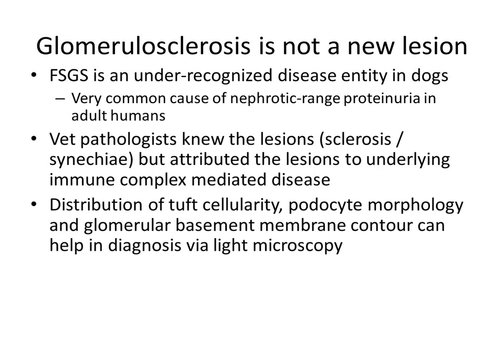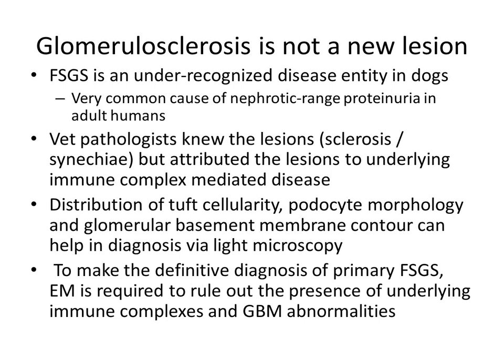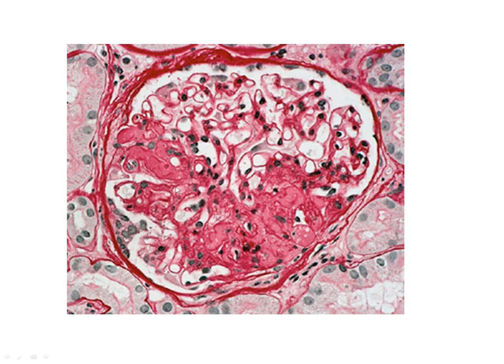But if we pay attention to where the cellularity is located or what the podocytes look like, that can help us get to the right diagnosis via light microscopy. But then again, you're still going to need EM or IF to definitively rule out the presence of deposits. This is just a different dog, but you have a normal tuft here. You have a podocyte that looks upset, but this isn't hypercellular, this isn't too many cells, and this area right here is sclerotic. So that segmental nature should get you on the right track for this diagnosis.